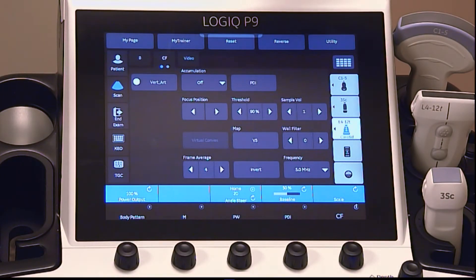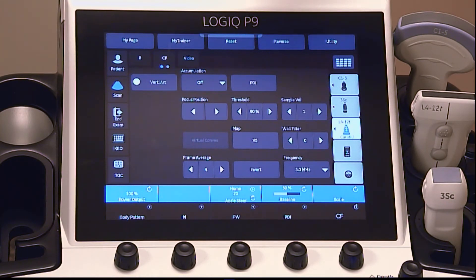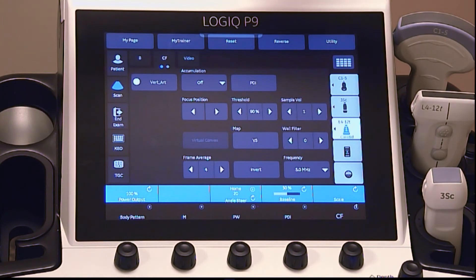Invert allows blood flow to be visualized with different perspectives. Red on the color bar will be displayed as negative velocities, or away from the probe, and blue will be displayed as positive velocities, or towards the probe. Invert can be adjusted real time, or when frozen.